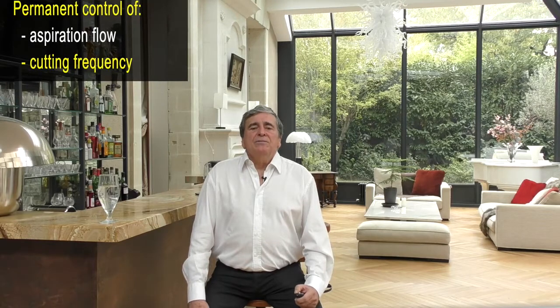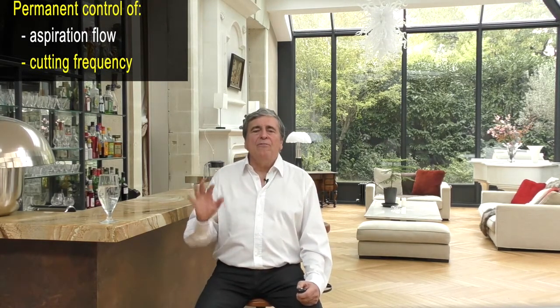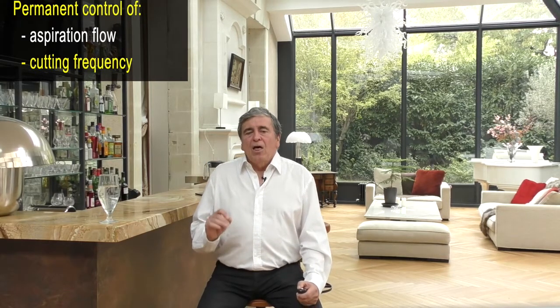Let's now move on to the control of the cutting frequency. But first of all, let's see how the vitreous is cut. The problem is that the vitreous is not a Newtonian fluid like water, BSS, honey, or oil. If you apply even a tiny depression on the Newtonian fluids, it will move. But the vitreous is a non-Newtonian fluid. Its cohesive and elastic fibrillar properties allow it to move only by deforming.